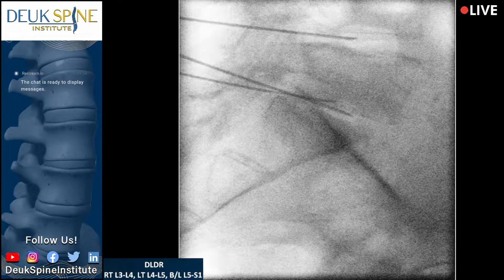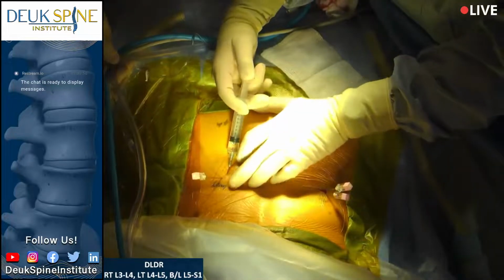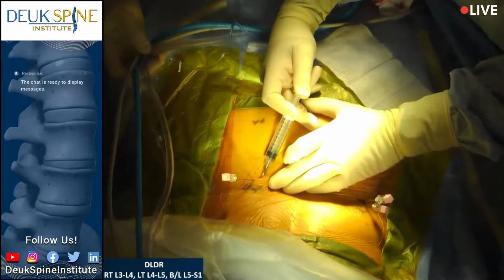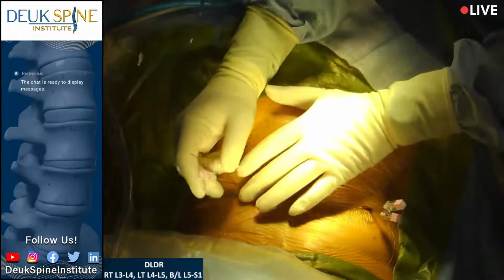What did you say, ma'am? She trusts you. I know. I appreciate that. I'm sorry, I know it's uncomfortable. Shot? This is the worst part of the whole surgery. Once we get past this, it'll be a lot better. I may have to start a little higher. I think we'll be all right. I think we can get 3-4 and 4-5 here. Thank you very much. We're just so close.